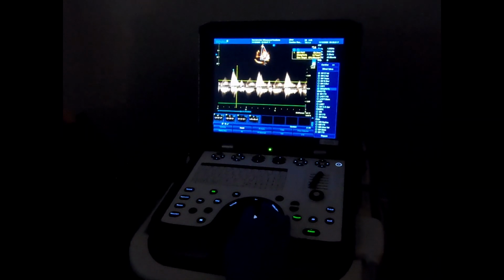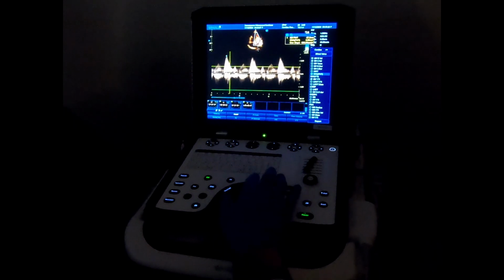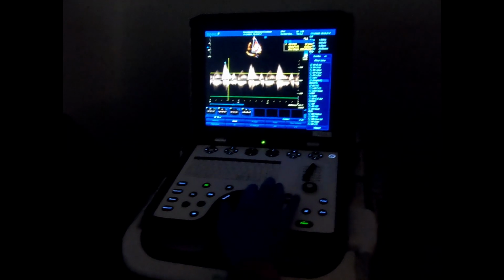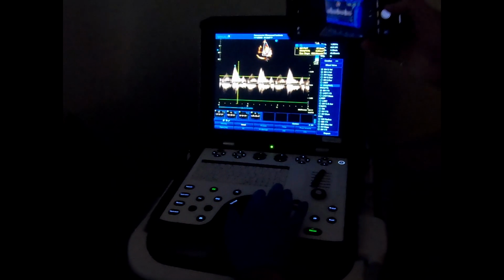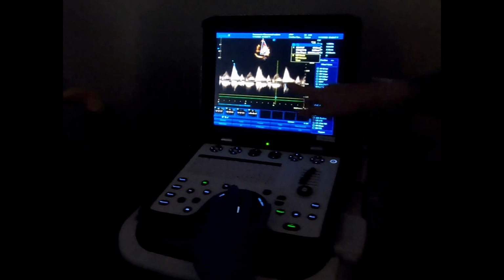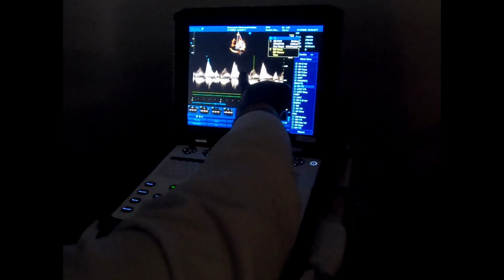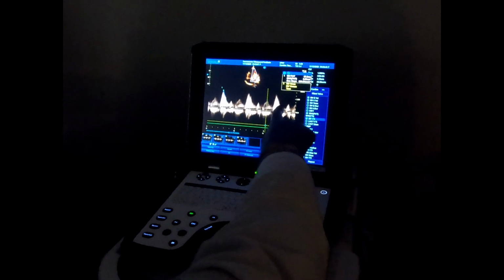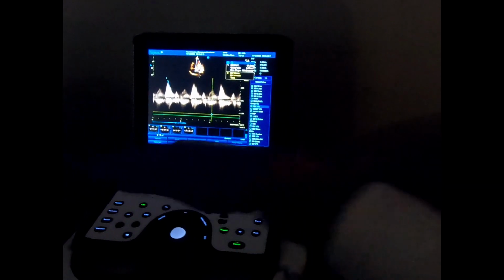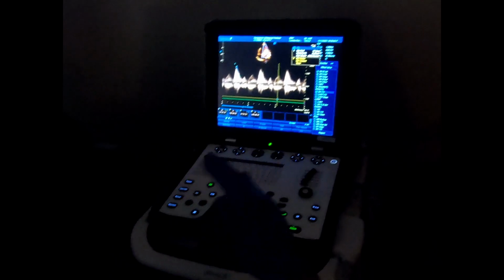Of the next one. Okay, and that's the pressure half time. That's the beginning of the next one. Can you go all the way down to the curve part? No. You see there's a landing for all of these whenever the waveform, and then you have this type of horizontal waveform. So you need to stop before that landing.